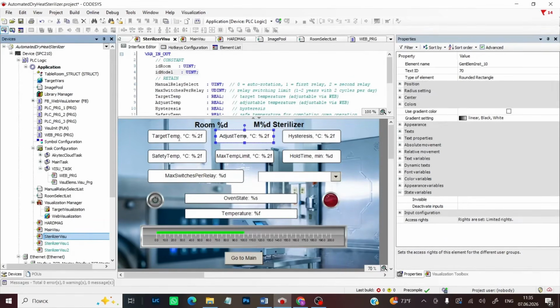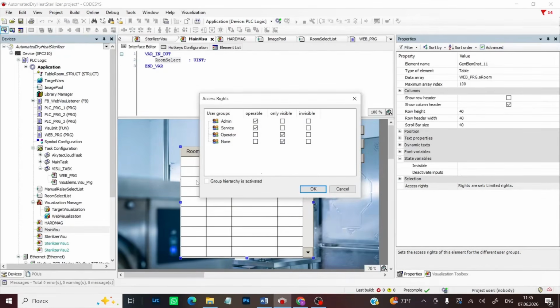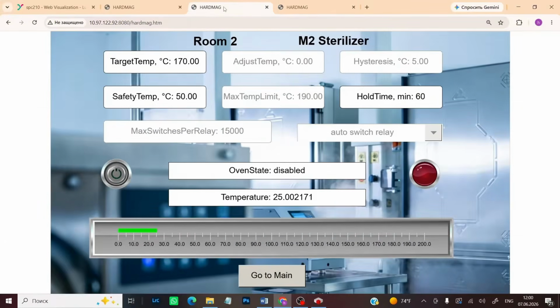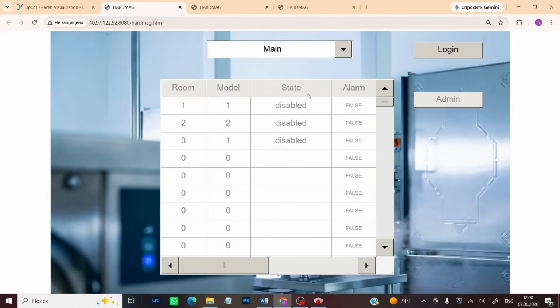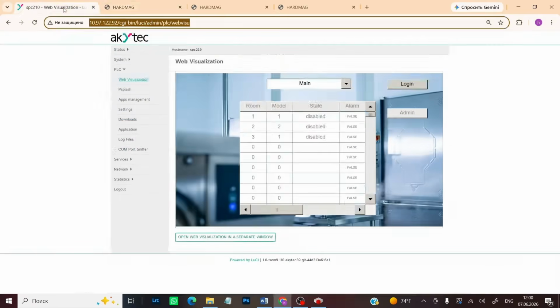Next, for all visualization components of the sterilizer and the main page, I set up access rights in the access rights field. Let's demonstrate how all of this works. Now, up to 100 clients can simultaneously connect to our control system through a browser on any device, select a room number, and control those system elements that correspond to their access rights.